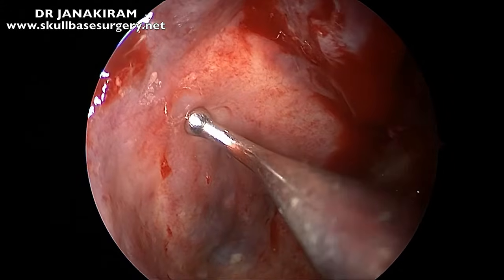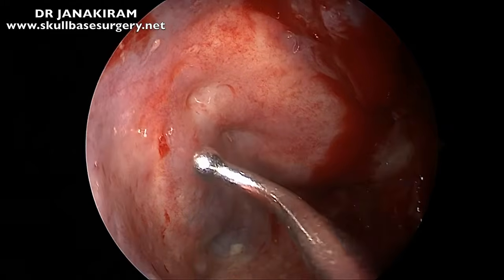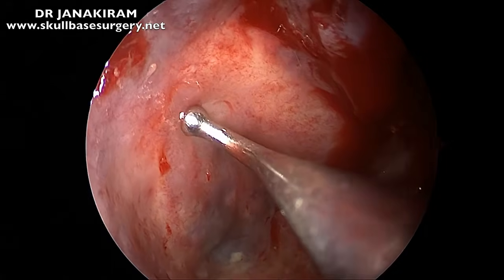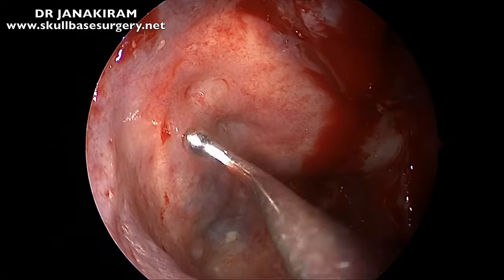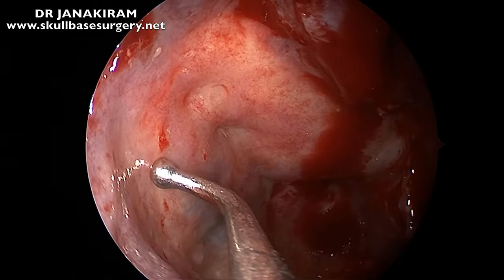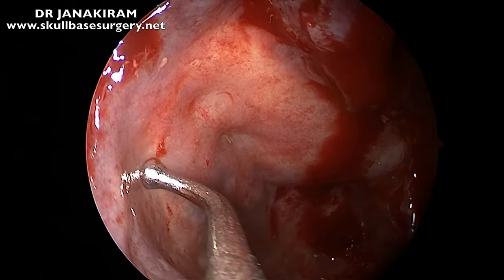and that is the optic strut, lateral opticocarotid recess, and this optic strut separates the optic canal from the superior orbital fissure. That is the anterior wall of the cavernous sinus there, very clearly seen, and that is the superior orbital fissure, which is just anterior to it.